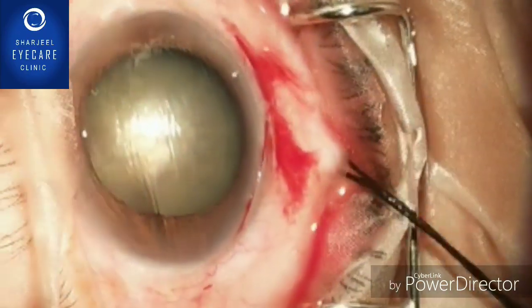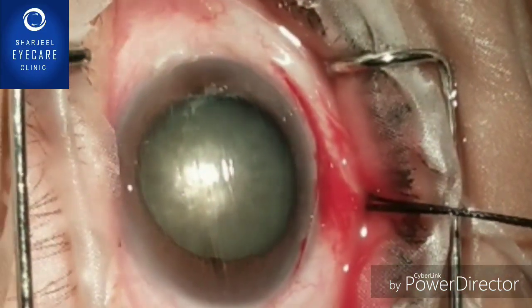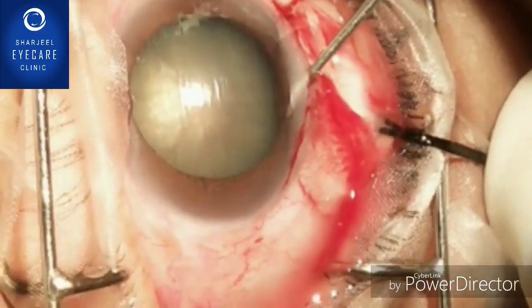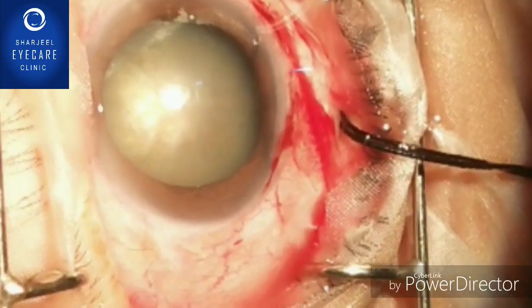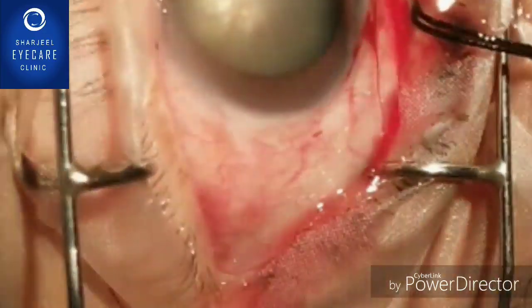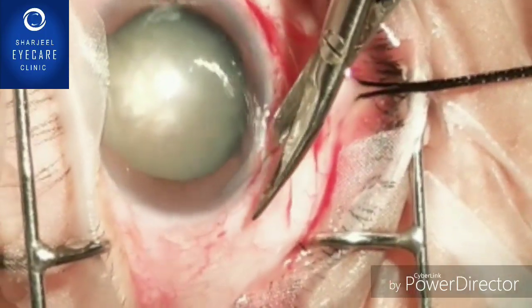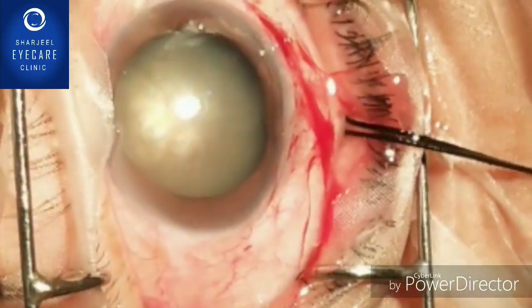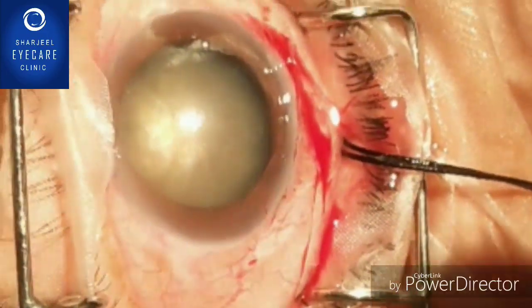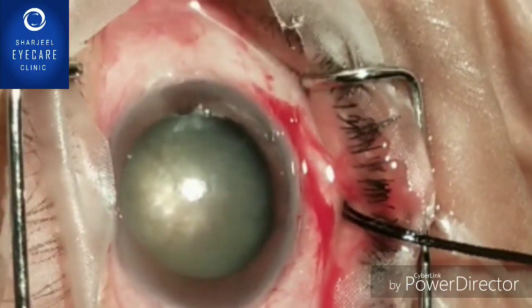Just after giving the nick, the lens was moving dangerously and we came out because there is a chance of a nucleus drop. So now, after putting viscoelastic, in such cases you should complete the rhexis with Vannas scissors. To enter the Vannas scissors, you have to make a large cut so that the movements of the scissors will not hinder.